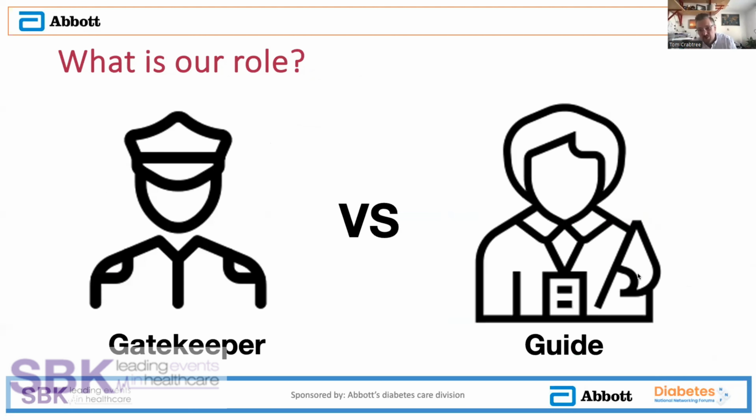And then this brings me on to reflect about what our role is as clinicians, because historically, I feel like pump services have been gatekeepers where we said, actually, you can have this technology, you can't. But more and more, given how broadly accessible hybrid closed loop is with the technology appraisal from NICE, we need to be guides more than gatekeepers and support people where they meet the criteria to choose closed loop and figure out which system is going to work best for them.